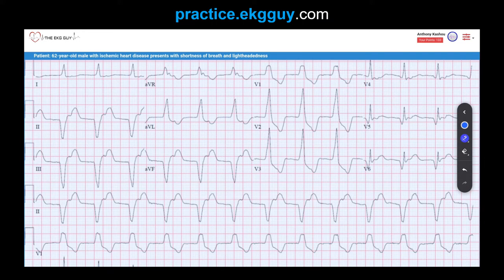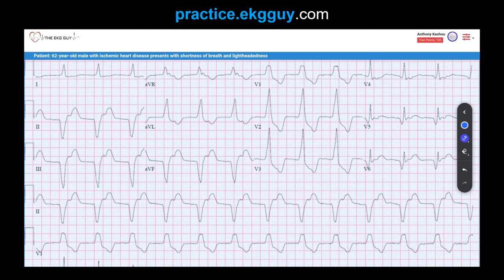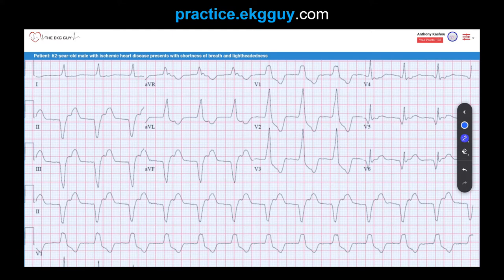Why do we say that? First of all, notice that the QRS complexes are wide throughout — they're clearly wide. It's regular, so if you look at these R-to-R intervals throughout, this is a regular R-to-R interval. That's where the regular component comes from: a wide, regular rhythm.